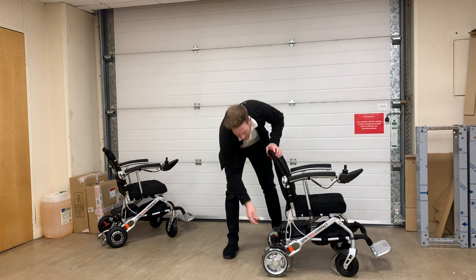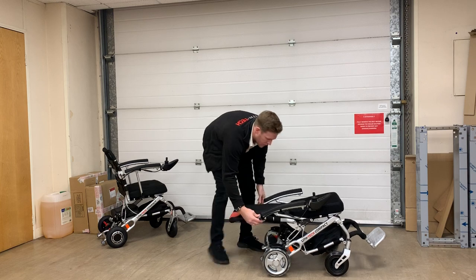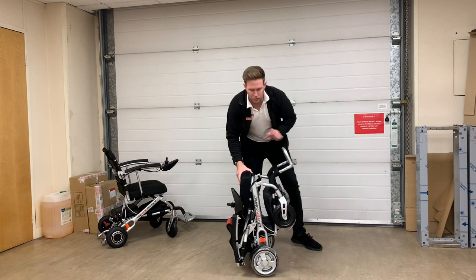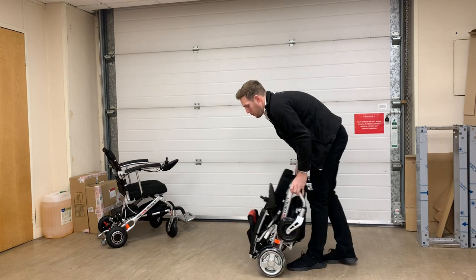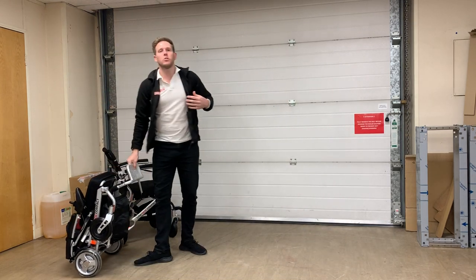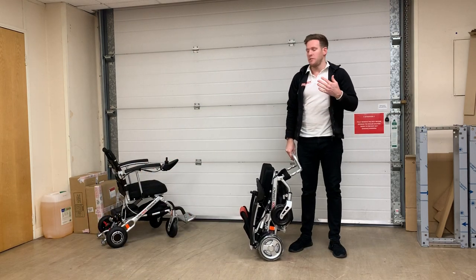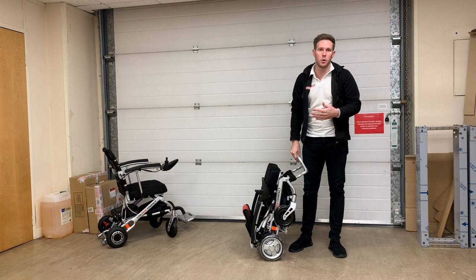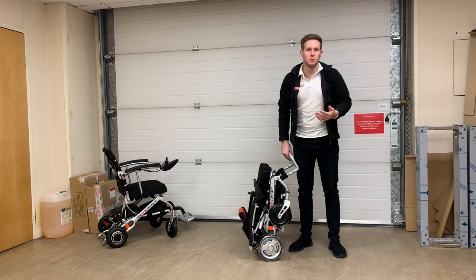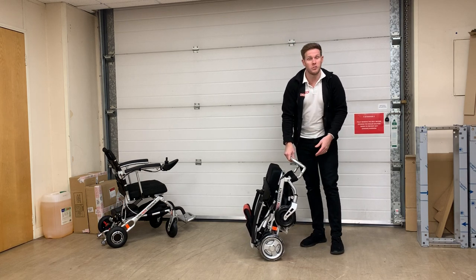Another great design feature is that when the chair is in its folded position it can also be used around the house — it can be pushed or pulled. Although the chair is incredibly lightweight, if it has the option to be pushed or put in free-wheel mode, why lift it? You might as well save yourself the backache and just push the chair around.